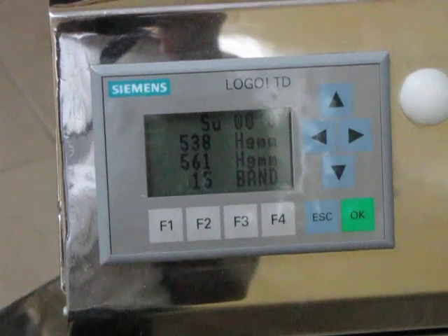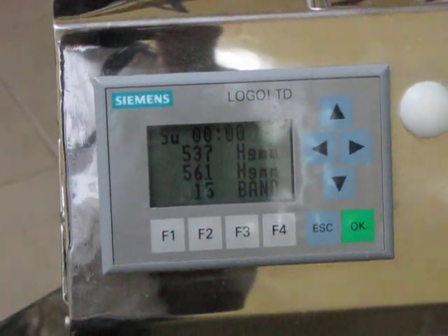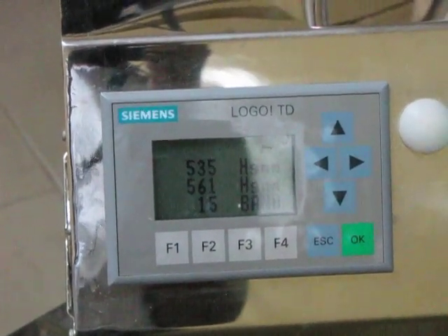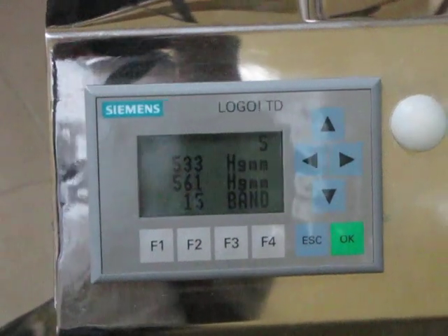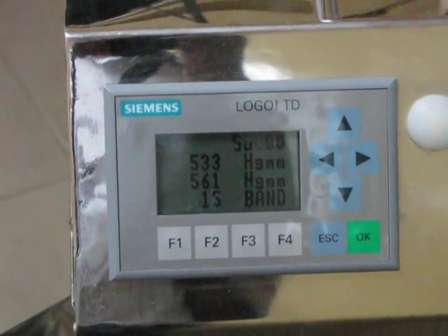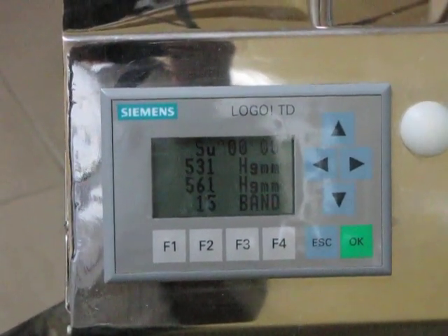We can control the error of the sensor and we can program the machine to deliver negative pressure continuously or intermittently. The wave pattern can also be programmed. This machine was proven very efficient, very successful, and very safe during our trials. Thank you.